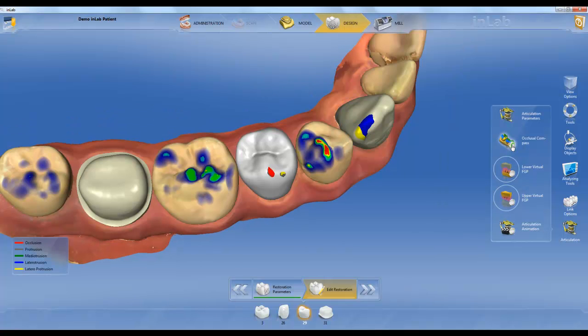It will greatly reduce the amount of finishing time we have at the lab and, more importantly, chairside. These are extremely valuable tools on cases with physical models and, more importantly, with modelless cases we receive through Sirona Connect.